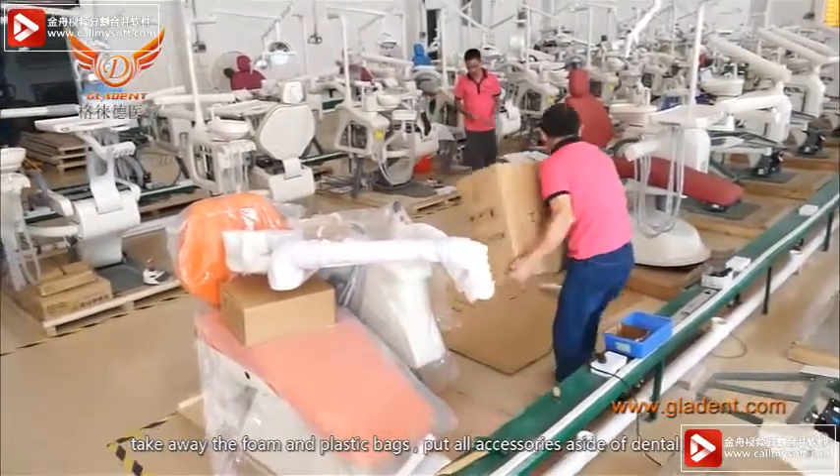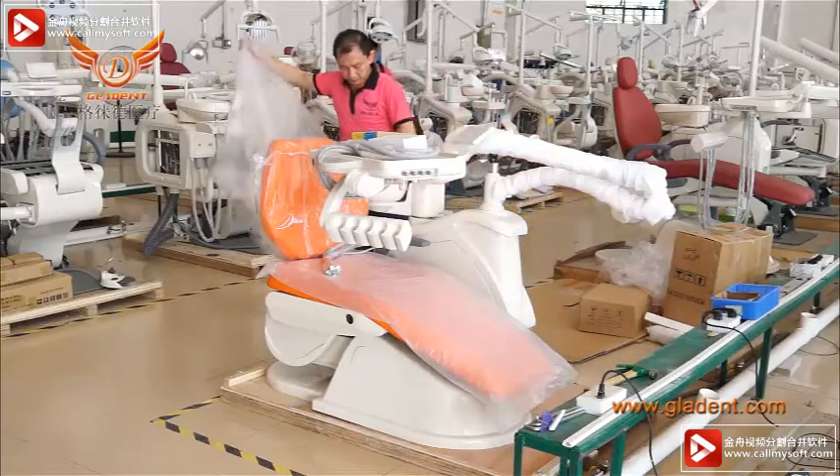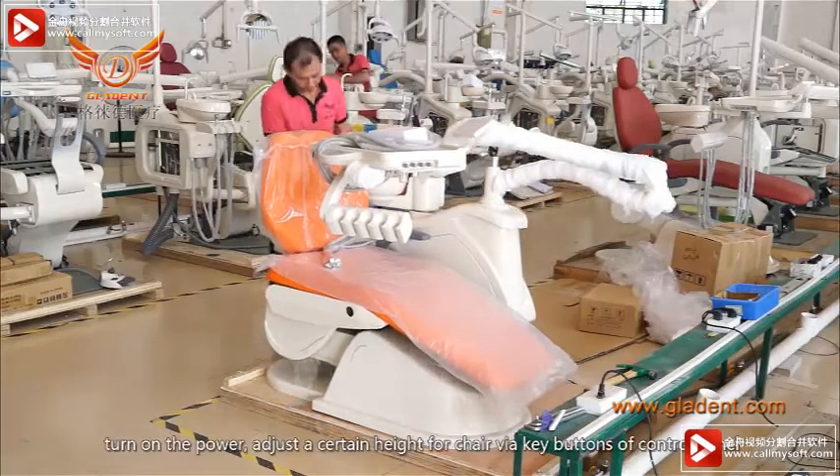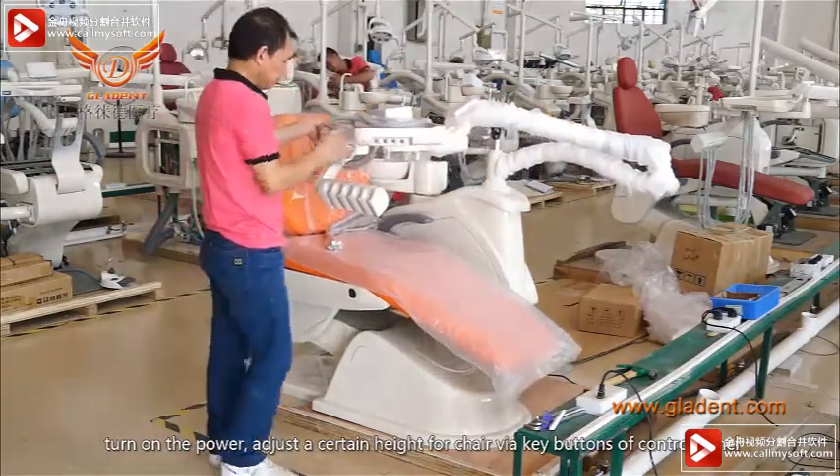Place all accessories to the side of the dental unit. Turn on the power and adjust the chair height using the key buttons of control panel.